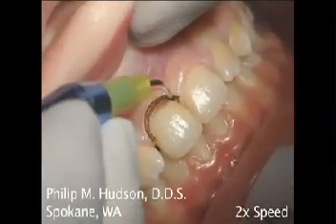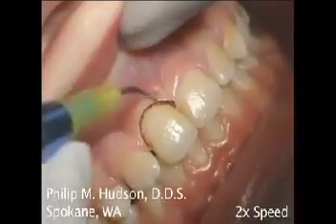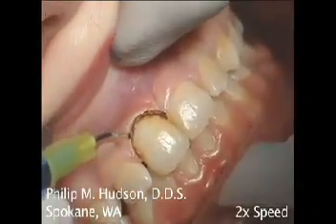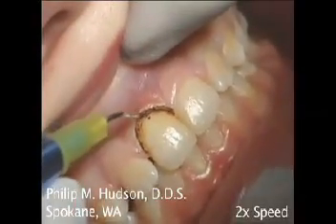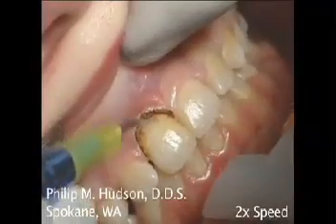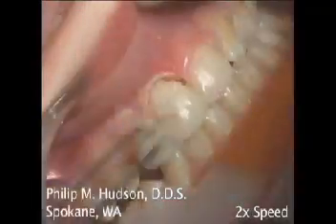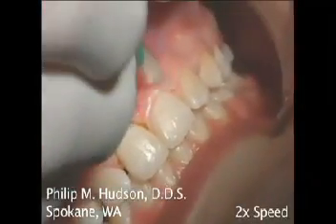The gingival tissue is then cleanly peeled away with the laser. Refinements are then made to the free gingival margin as needed to establish the height of contour on the distal third of the facial surface of the central incisor. Debris is continually removed with the tip of the laser during this process. Dr. Hudson then scrubs the area with hydrogen peroxide and sprays off any residual tissue with an air-water syringe.